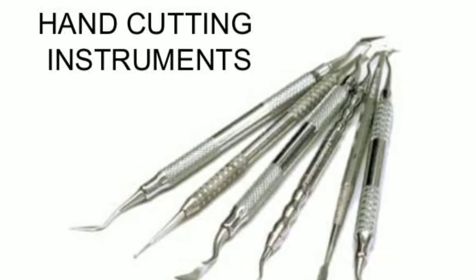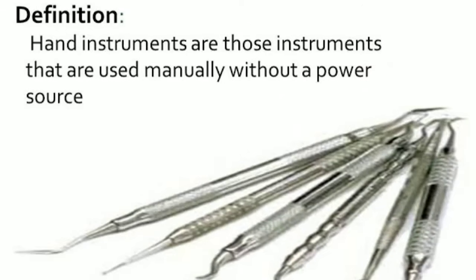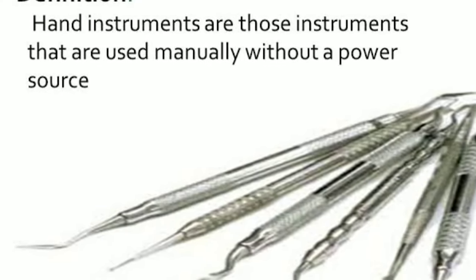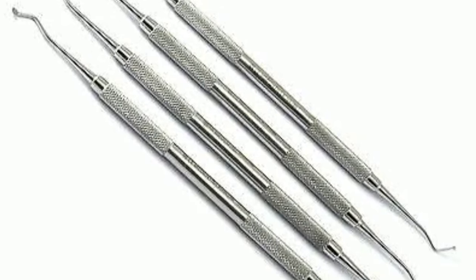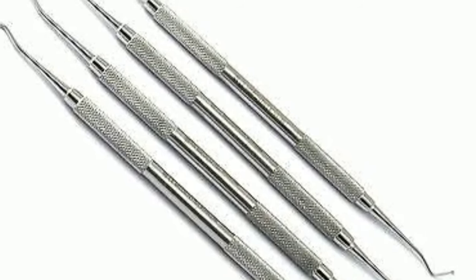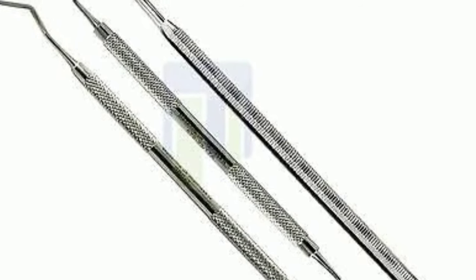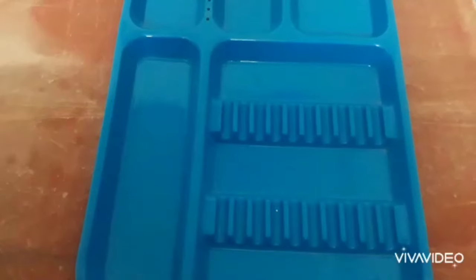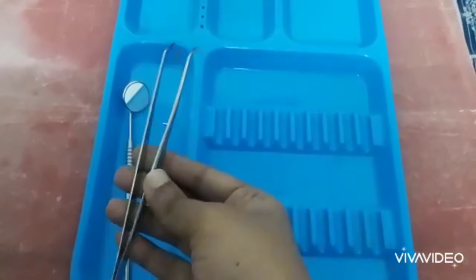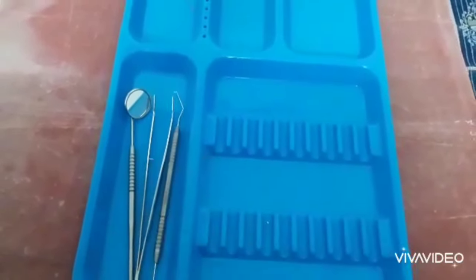In this video, we look at how to arrange hand cutting instruments properly. First, we arrange the instruments in this order: diagnostic instruments, cutting instruments, filling instruments, and finishing and polishing instruments.